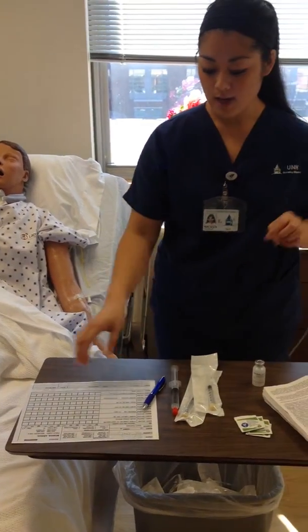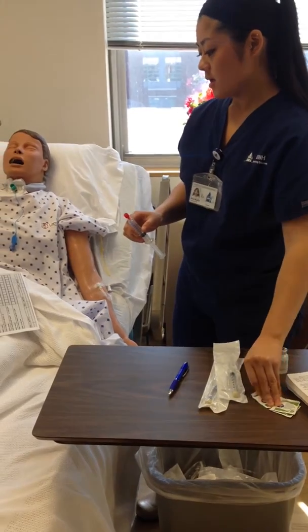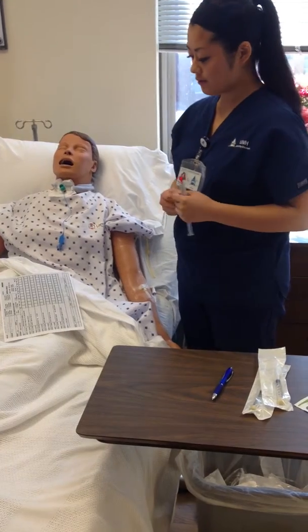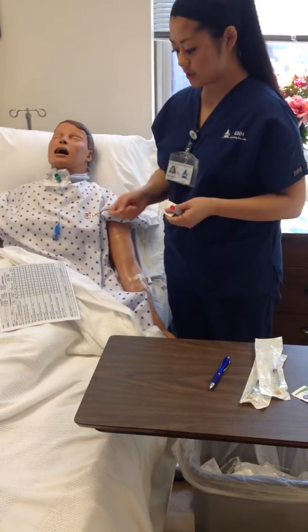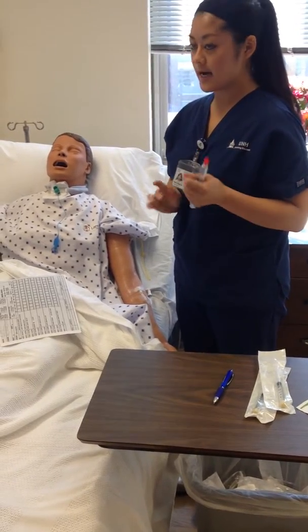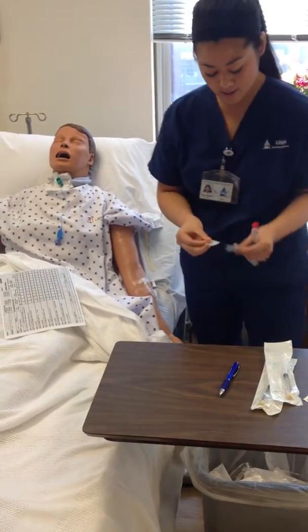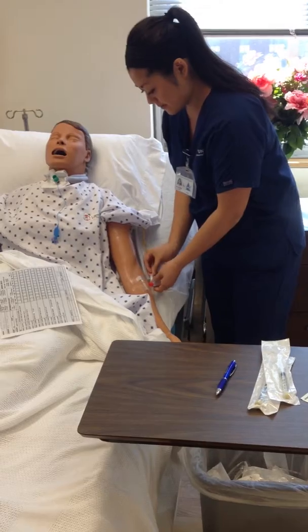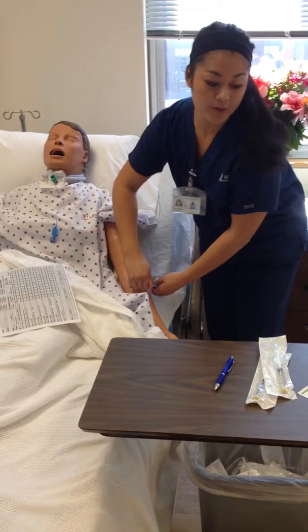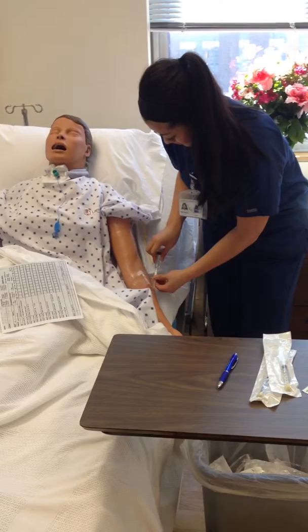Now it's time for the drug, and we're going to do our rights of assessment again before we give it. So we have the right patient. We checked that earlier. We have the right drug, hydromorphone, 1 milligram. We have the right dose. We have the right route, IV push, time, PRN, and documentation we can go over after we administer. So we're going to scrub the hub again. And as we looked up in the book, the rate of administration is over 2 to 3 minutes.